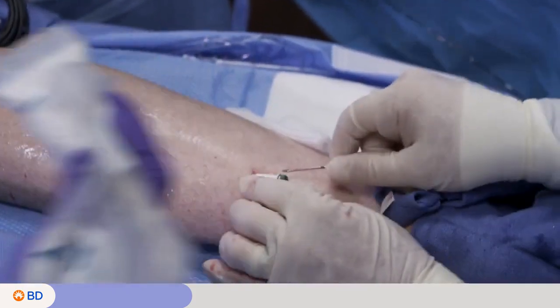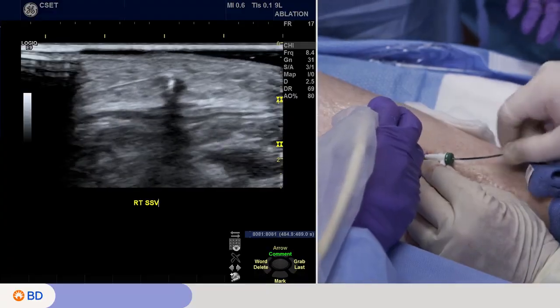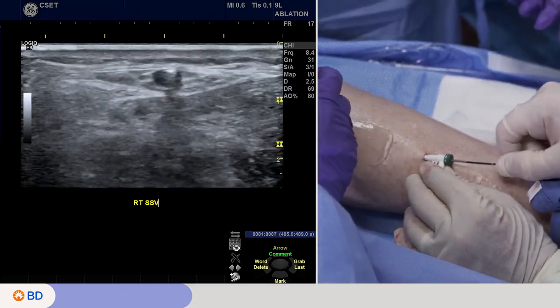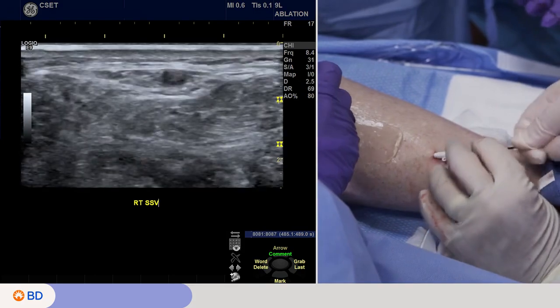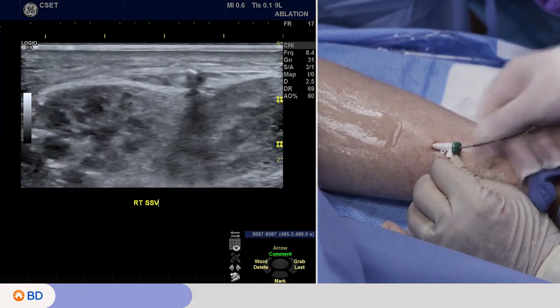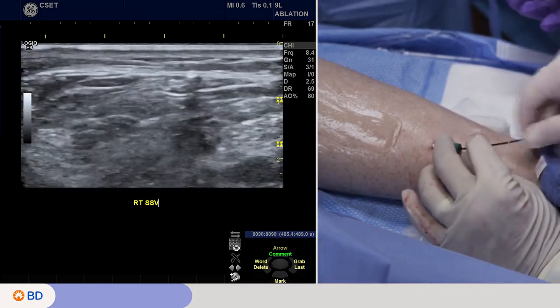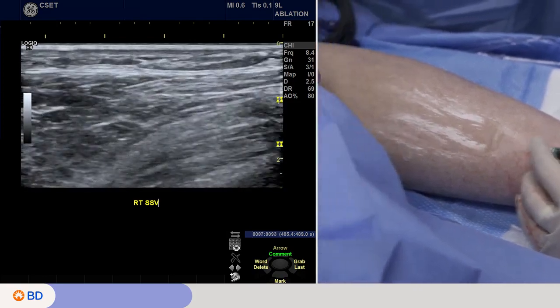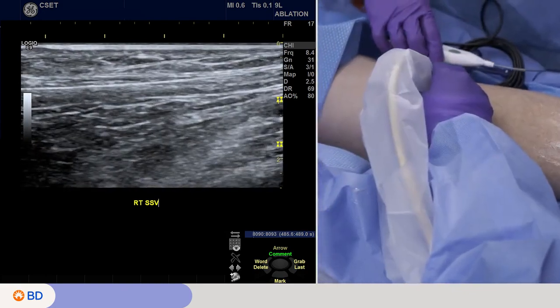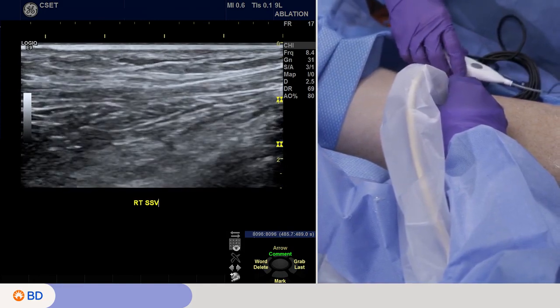So we put the catheter into the vein, and again, we like to watch the transfer. I'm feeling, and I actually found some resistance pretty early on here. And I just torqued the catheter because of the shape, and it just nicely got past that little resistance that might have been a valve or a side branch. So it's important not to just ram this through, to feel and have that tactile response, so you know if there are any barriers to transmission.